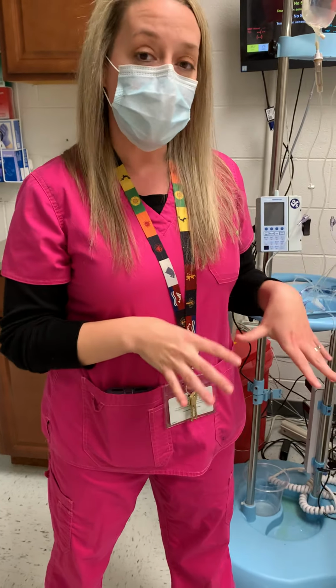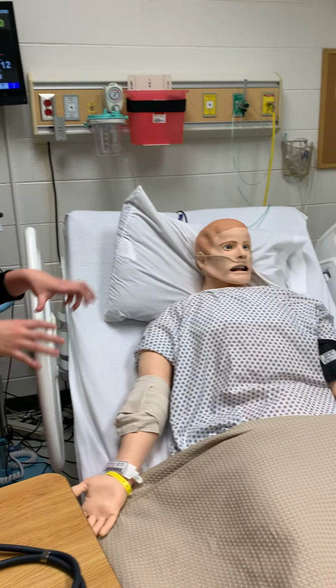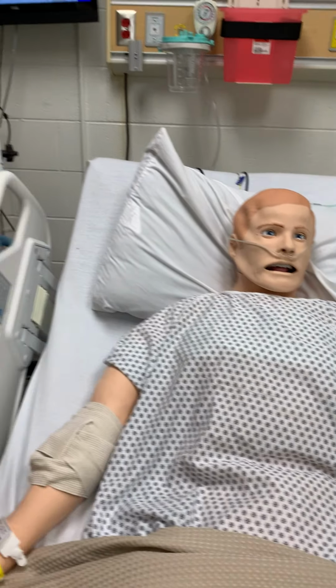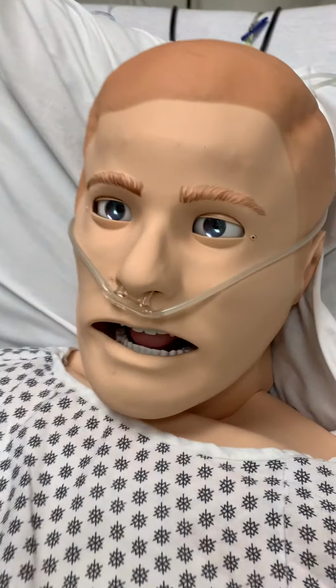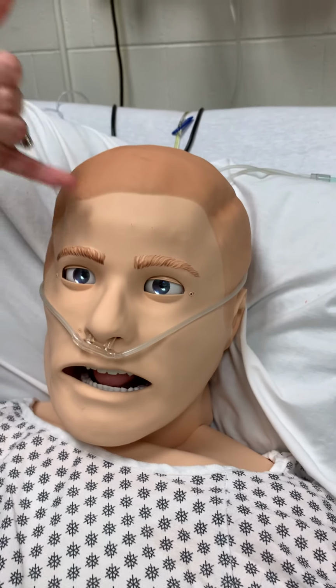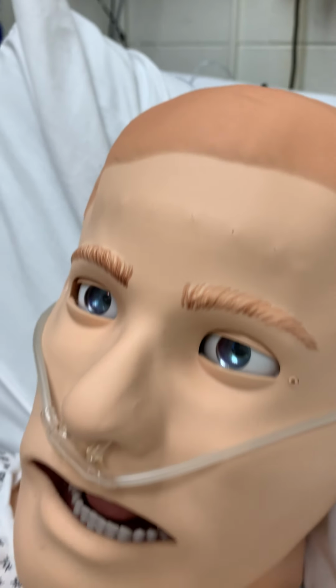So as a nurse, you play a really important role in the healthcare system. In the sim lab, the first thing I tell students when they come in here is that they have to treat this mannequin just like it's a real patient. They're going to treat this environment just like it's a real hospital, so we're going to use real tools. Our mannequins are high fidelity, which means that they have a lot of features that are just like a real person. They blink, as you can probably see right now. They have little holes up here where they can sweat and cry. Their mouth can turn blue if they're not receiving enough oxygen.